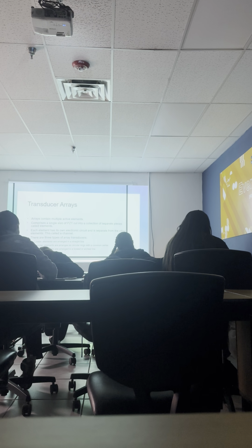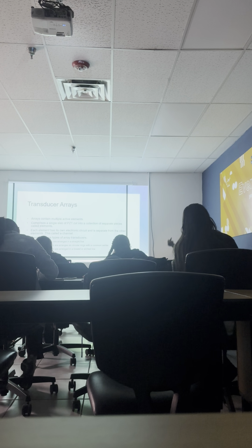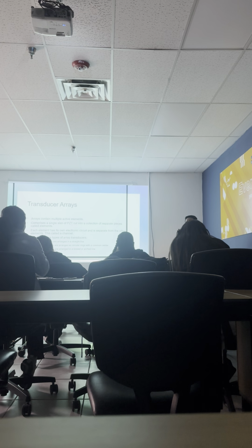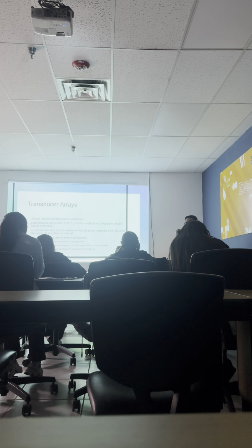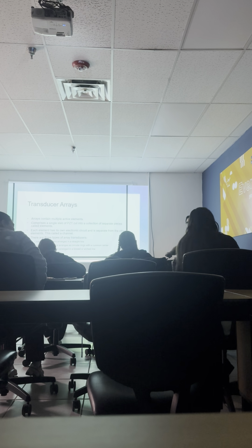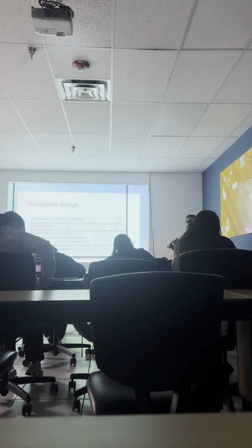No, I'm saying, in the linear probe, is it all the same? Oh, yes, they're all the same. In every probe, those crystals are the same. Exactly the same size and shape? They would have to be the same size and the same shape because they're using one mathematical equation to make our image. Thank you.